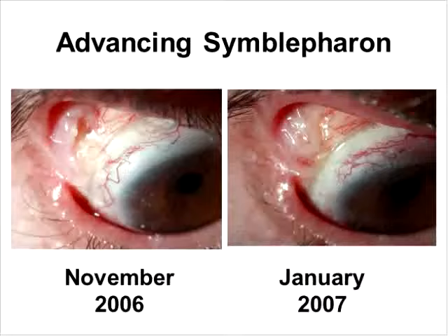And in some cases, I've heard in other settings to use a scleral lens as a conformer. This patient was referred to our office for that very reason. A patient with retinoblastoma, enucleated the left eye as a child. She had radiation to the right eye and a recurring symblepharon that had been surgically treated. And so she arrived at this point, and we fit a larger lens on this eye, and we fit kind of flat here, trying to prevent this symblepharon to advance.